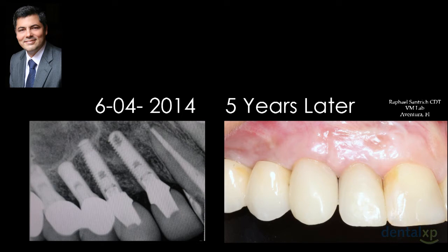So the answer is when we have a tissue punch case, these crowns are going to stand a chance. And what you are seeing over here is basically the fact that these crowns of the pilot study, we cemented with TempBond. We cemented with TempBond because we didn't know what was going to happen. We didn't know if we were going to need a new set of crowns, and we didn't want to destroy the abutments.